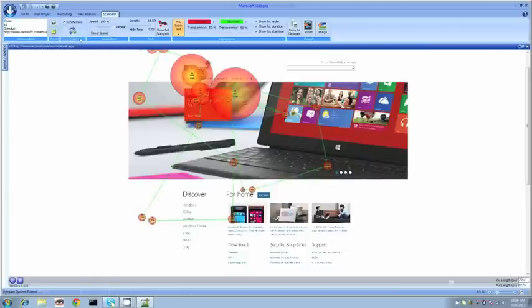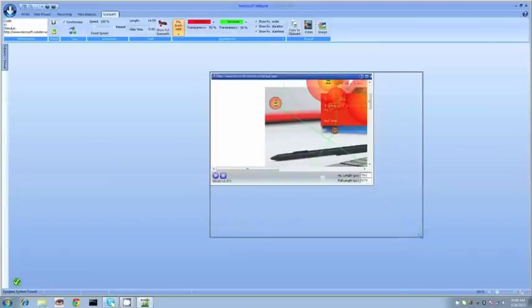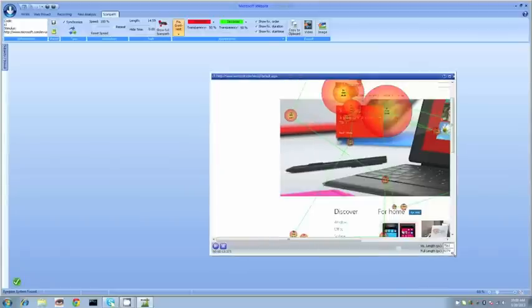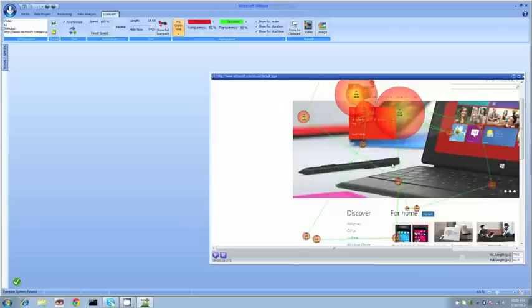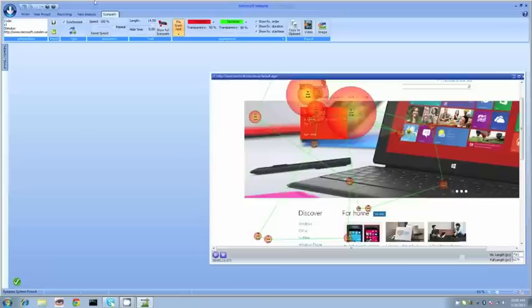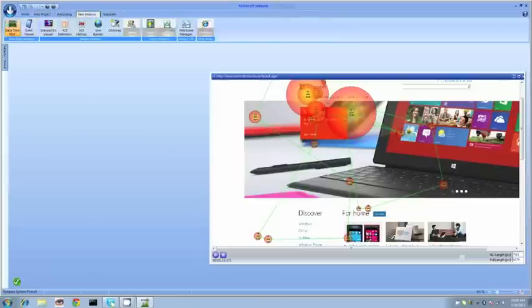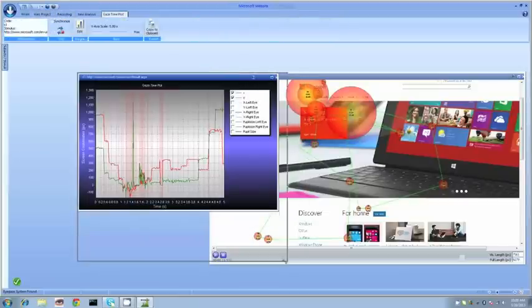What I'm going to do here is synchronize this. I can take that scan path analysis, move it to the side here, and I'm going to compare this to another measurement. This new measurement is called our gaze time plot.